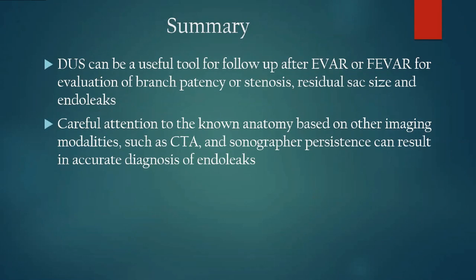In summary, duplex ultrasound can be a useful tool for follow-up after EVAR or FEVAR for evaluation of branch patency, stenosis, residual sac, and endoleaks. Careful attention to known anatomy based on other imaging modalities such as CT and sonographer persistence can result in accurate diagnosis of endoleaks.